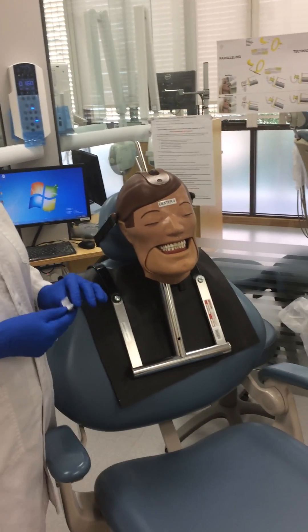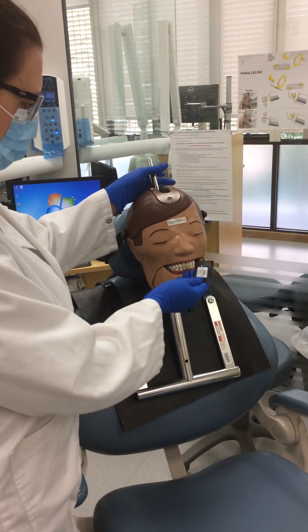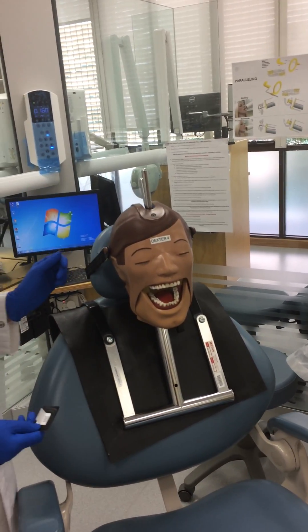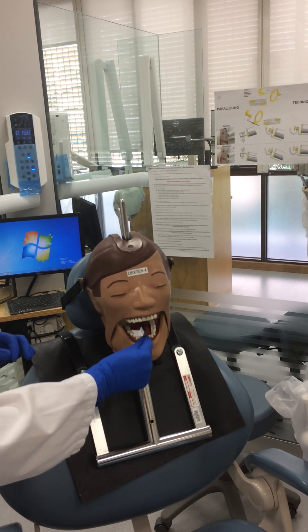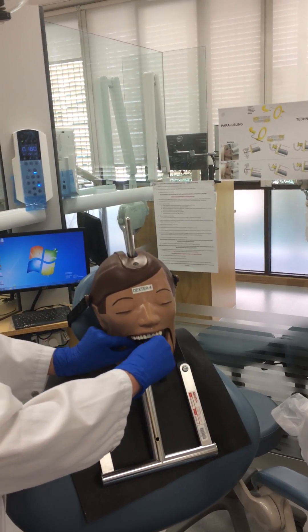This is not teaching you how to take this particular bite wing — it's just showing you the process for taking a radiogram. You make sure you open the patient's mouth very wide. When placing the phosphor plate in the mouth, you don't come in like that; you come in from the side and then turn it on its edge as you place it in.